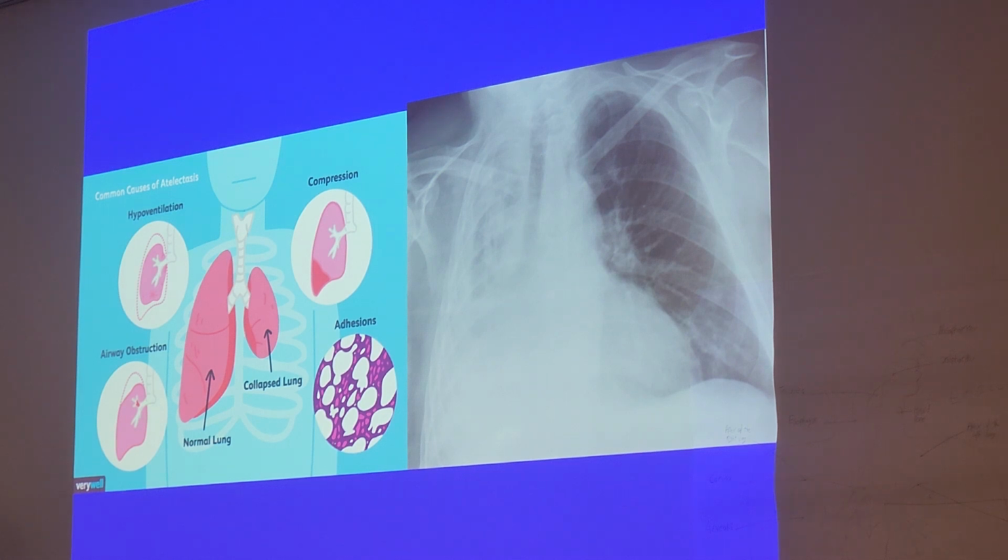Seems that way, but atelectasis again, guys. Atelectasis is a fancy way of saying collapsed lung. That comes up a lot on questions in regards to technique. So, great situational question to think about, guys. Patient presents with atelectasis of the right lung. You see the X-ray there. What would you do with your radiographic technique? Would you increase the mAs or decrease the mAs? And why? I'm hearing both. So I heard increase first. Why would you increase the mAs?